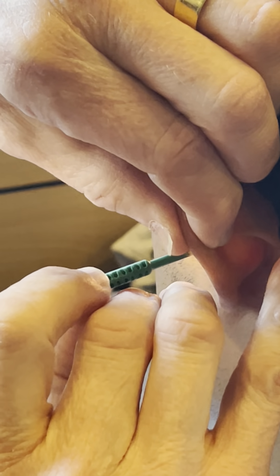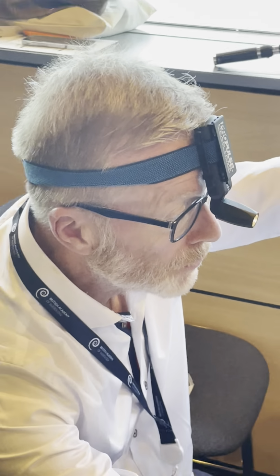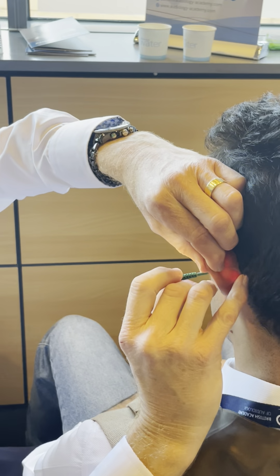Now, one of the things that you do need to do is just not be scared of going too deep. So really using those markers, because if you pull out too soon, you're just going to break a little bit off rather than getting a lot out. So, are you still okay? Yeah.